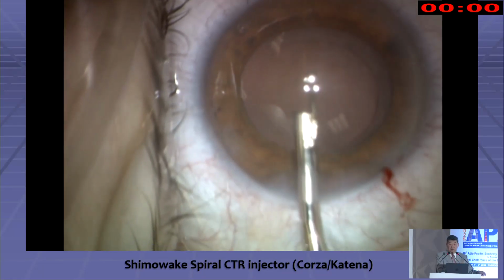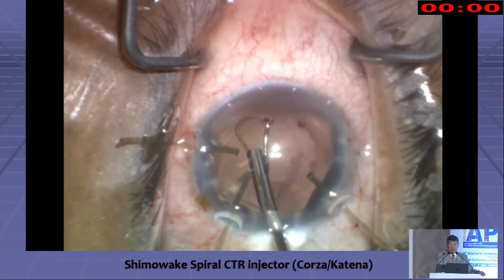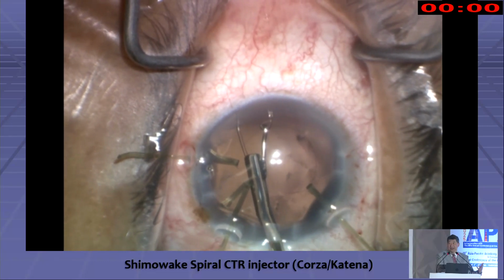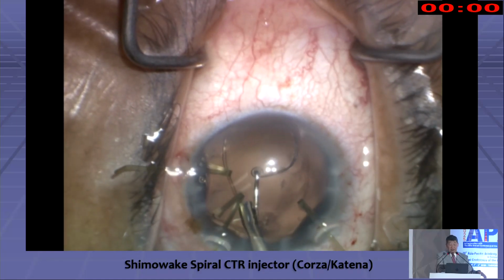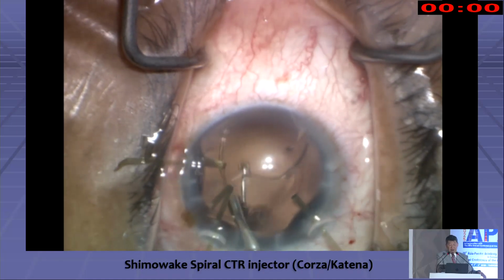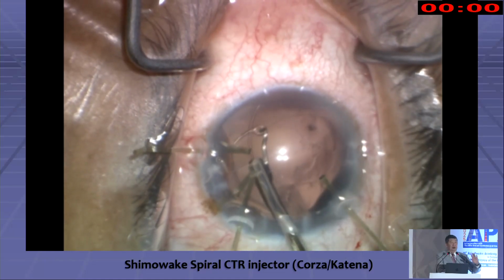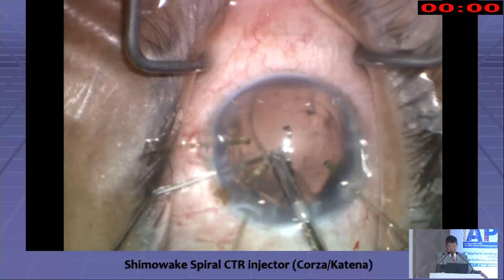This is obviously reusable. It's really nice when you have capsular retractors already there, because as you know, the ring kind of runs into the retractors. You run into these other areas sometimes where the bag has a fold. You avoid all those troublesome areas by the lead eyelet not having to go there.